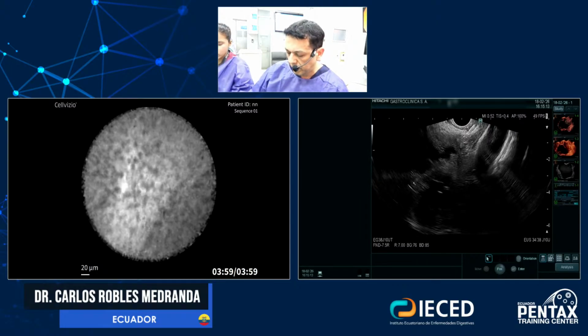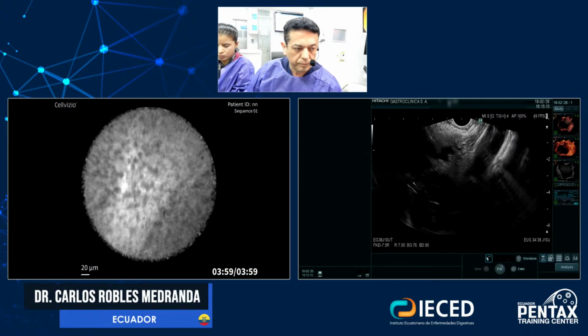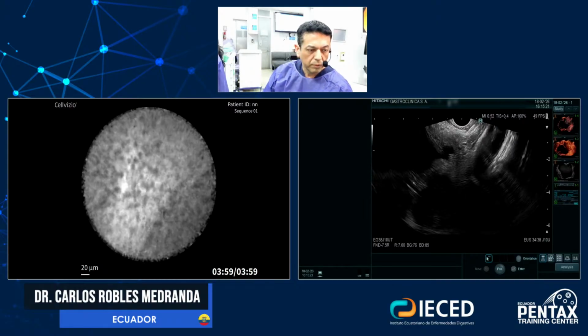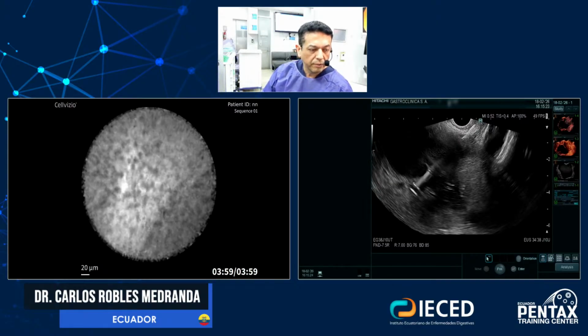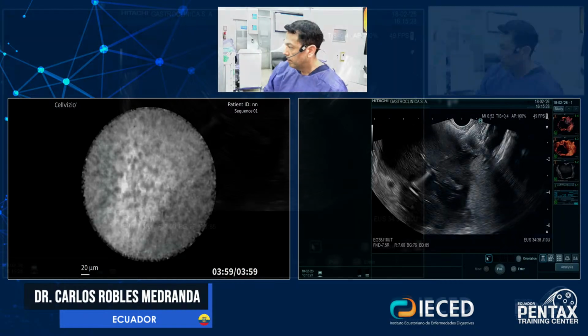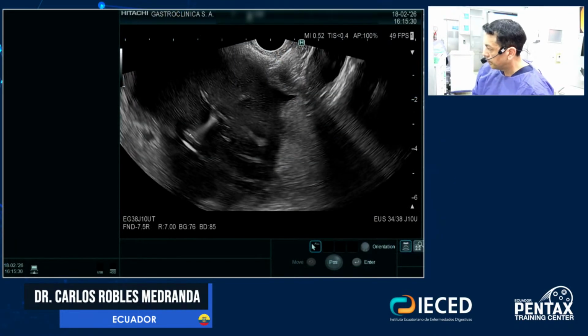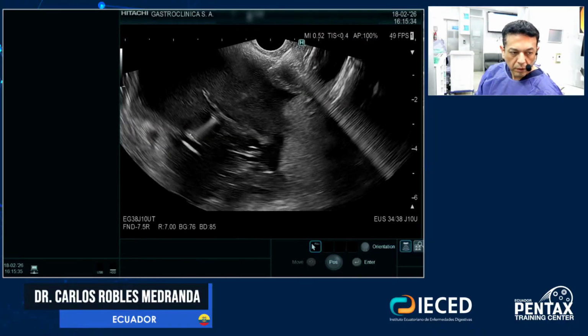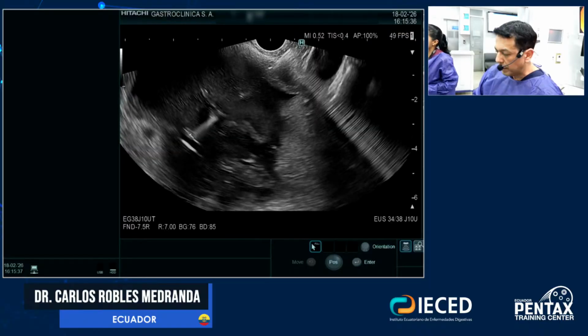Take it. You need to take care because there is risk of bleeding also, huh? So you see there is some bleeding inside, just small, you see? I can see it. Do you have something? I will take another one.